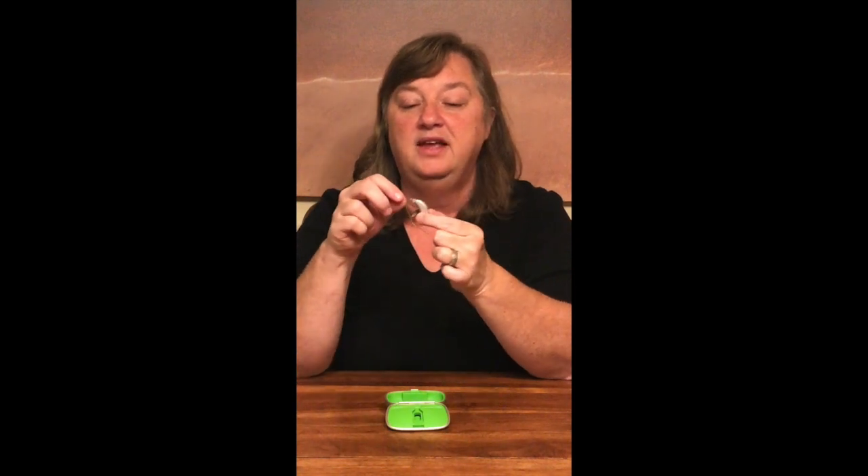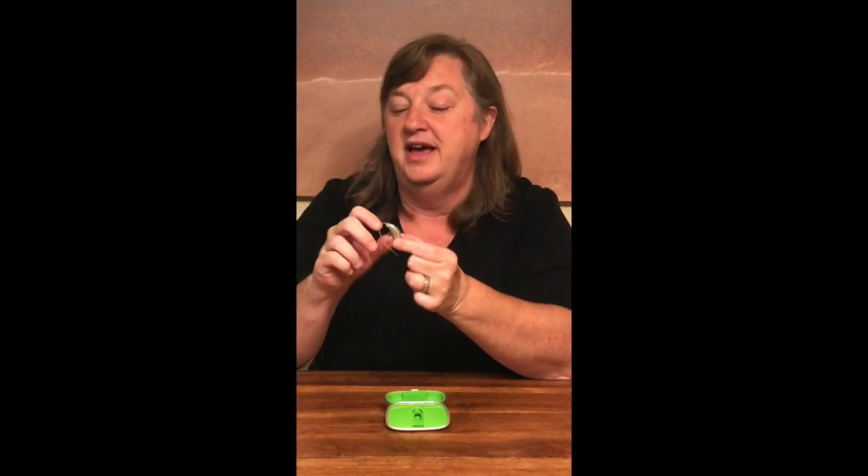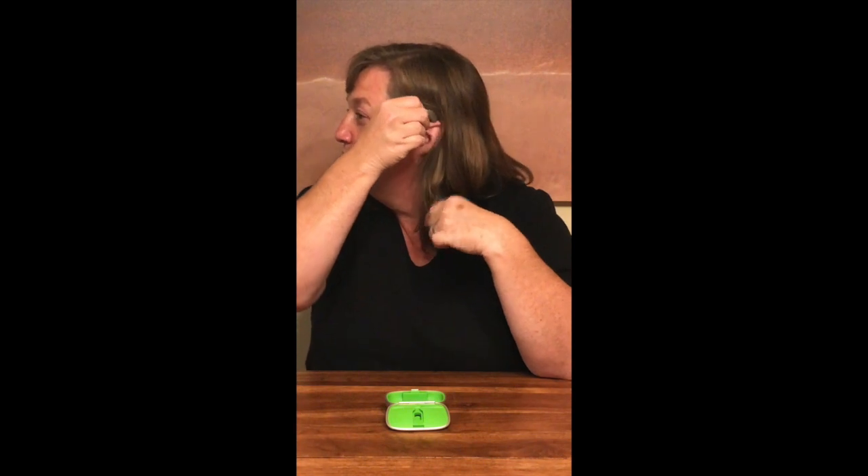I'm going to demonstrate this. This silver piece is going to go behind my ear and I'm going to put this gray tip into my ear canal. Behind my ear, this gray tip goes into my ear canal. Then there's a long plastic piece that you just fold up and it sticks in the outer part of your ear — it's just there to stabilize it.